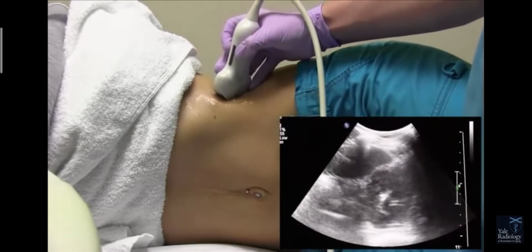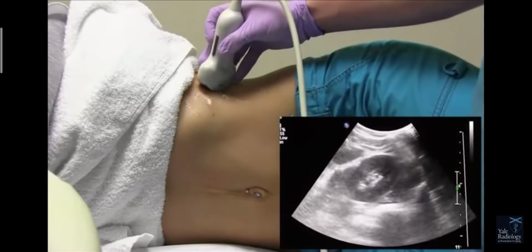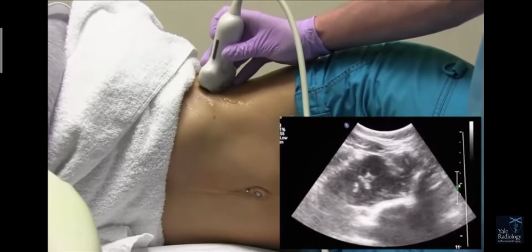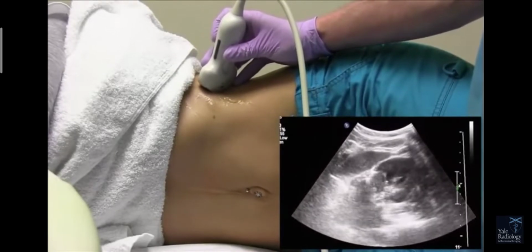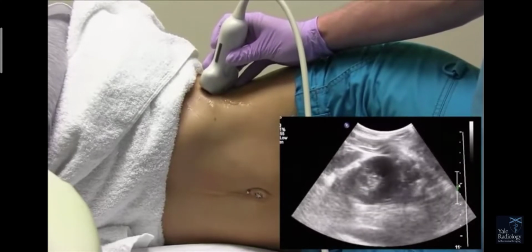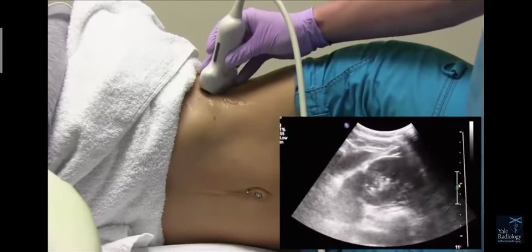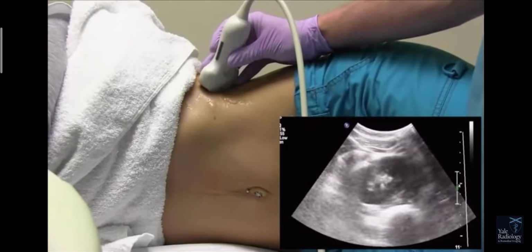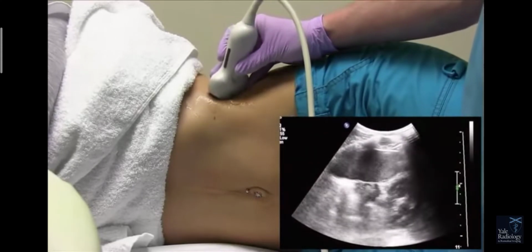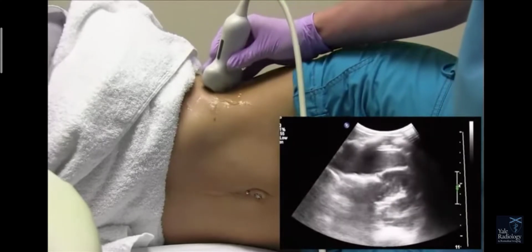For these transverse pictures, you may run into the rib spaces a little bit. And what I would do is, if you have to, you can use that intercostal space and just sweep through that if you feel like you're not getting a very good image of the upper pole or lower pole of the kidney. And you'll also see the spleen from this window again too.